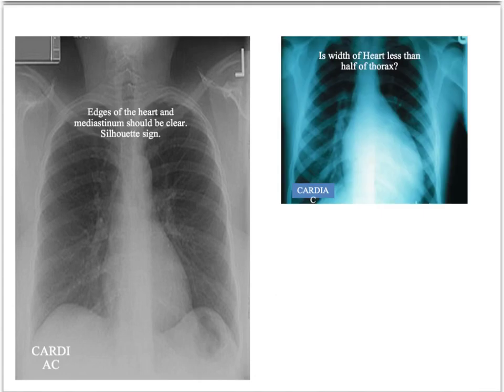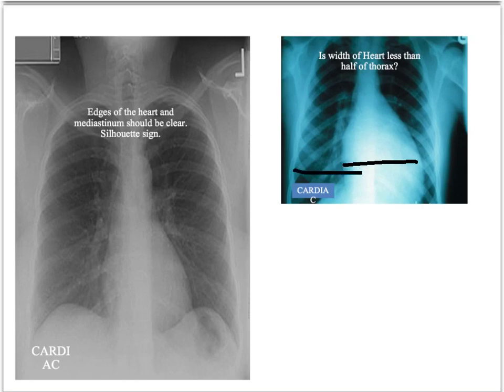Next, measure the size of the heart — but remember, this can only be done on a PA, not an AP X-ray. You want to know whether the width of the heart is less than half the width of the thorax. If it is, that is a reasonably normal-sized heart. If it is larger than that, you need to comment on cardiomegaly, which raises suspicion of heart failure.